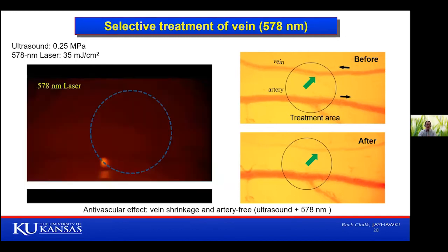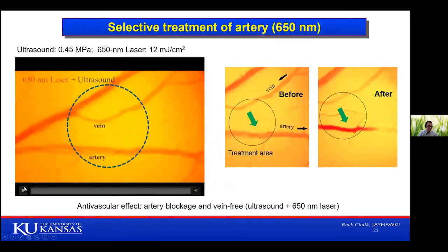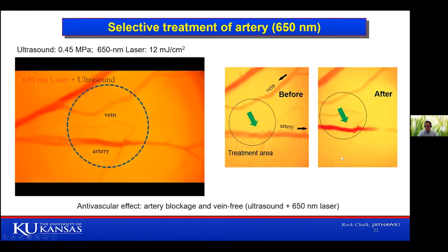And then the cavitation-produced bio effect will shut down the vein. And of course, on the other side, if we switch to another wavelength, in this case the artery has a stronger absorption, and as you can see, after a certain time this artery will be shut down. So this experiment basically shows that with photo-mediated ultrasound therapy, we do have a selectivity, which is based on optical absorption.